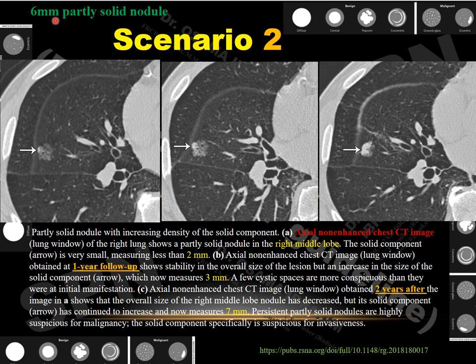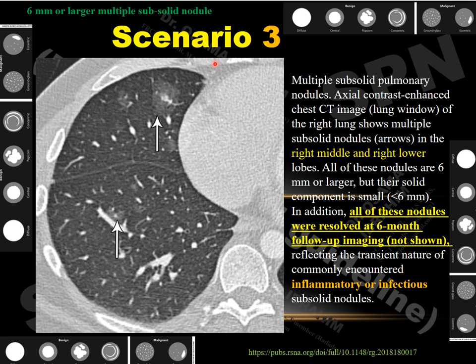Scenario 2: A 6 mm partly solid pulmonary nodule with solid and ground glass components in the right middle lobe. At one-year follow-up, the overall nodule size slightly decreased; however, the solid component became more prominent. At two-year follow-up, the solid component continued increasing in size despite the overall nodule size decreasing — highly suspicious for malignancy and invasion. Scenario 3: Multiple partly solid ground glass nodules (6 mm) in the right middle and lower lobes disappeared at six-month follow-up, representing inflammation or infection.